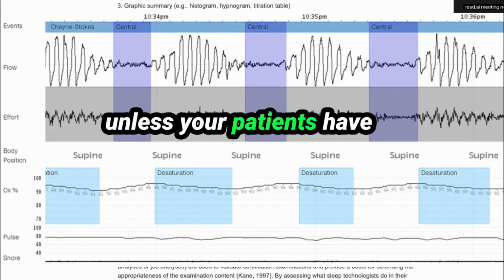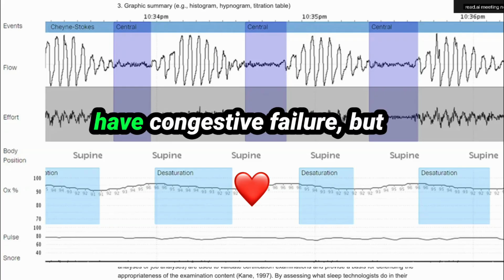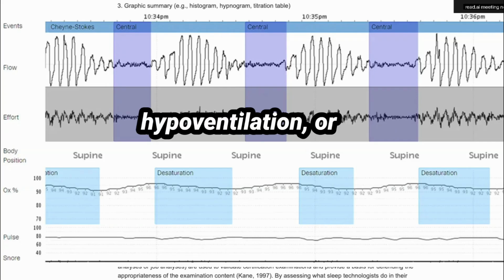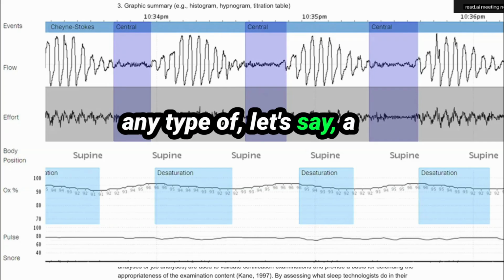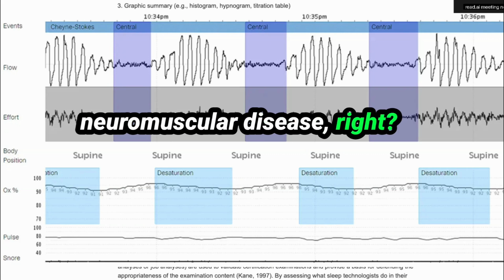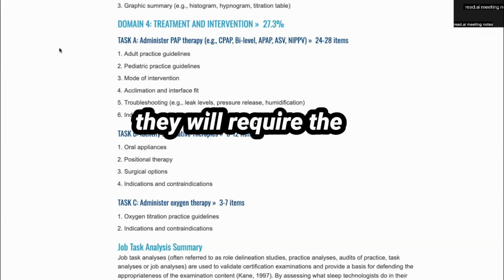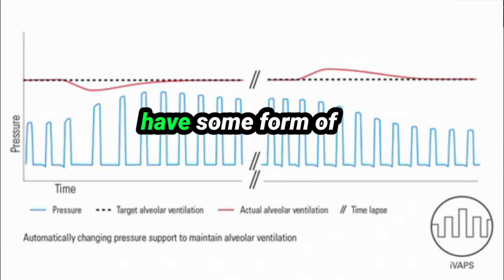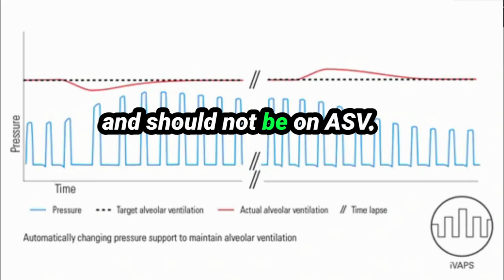Unless your patients have additional comorbidities, if they have congestive heart failure, but they also suffer from obesity hypoventilation, or they also suffer from any type of, let's say, a neuromuscular disease, right? In addition to their central apneas, then they will require the VAPS, volume assured pressure support. Okay, any patients that have some form of hypoventilation cannot be and should not be on ASV.